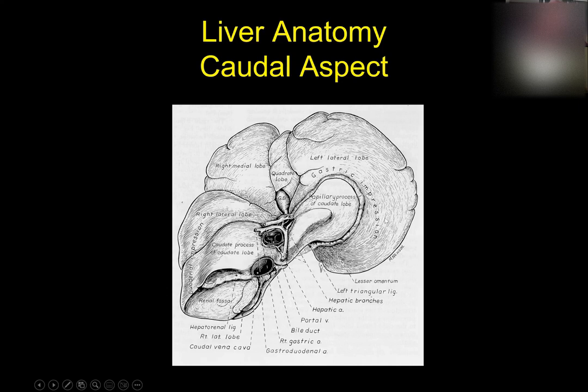Okay. And so we know that the liver, number one, you should know it has 6 lobes, and you should probably know the names of the lobes. But on the other hand, with ultrasound, in a normal dog, when you're scanning the liver, you can't tell where one lobe begins and one lobe ends. They all look the same. So sonographically, in a normal dog, the entire liver looks the same. You can't tell divisions between lobes. They all blend together. And so because of that, you don't need to worry about the names of the lobes of the liver with an ultrasound. You just say, I see a mass on the left side of the liver, midline of the liver, right side of the liver.